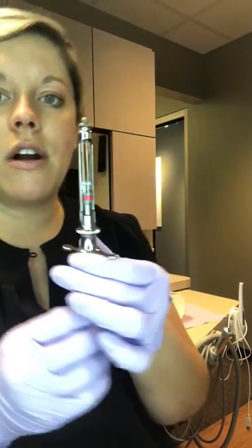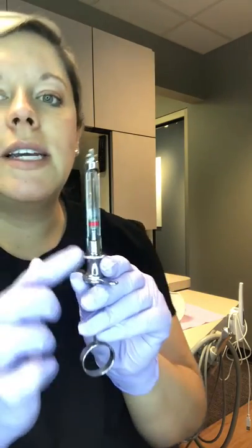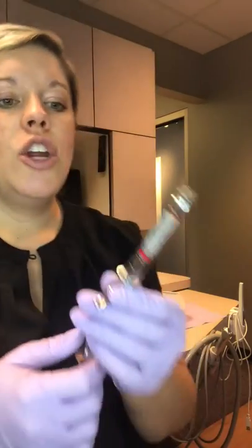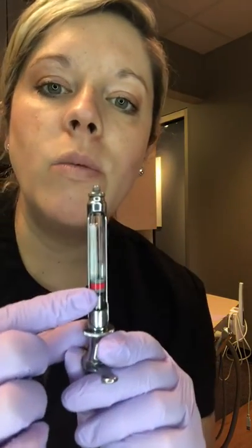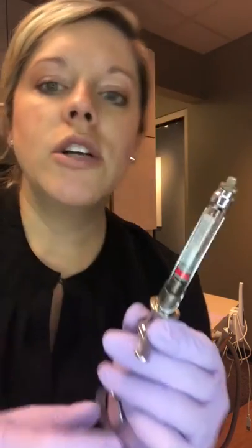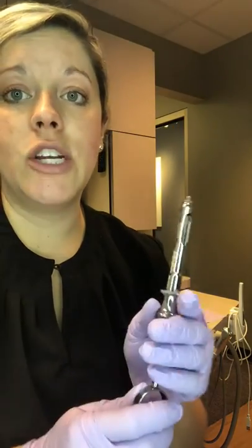We still have our needle and our cartridge left. To disengage the harpoon — that little arrow from your rubber stopper — you're going to want to pull back on the syringe quickly. If you don't, the harpoon will stay in that rubber stopper, the whole rubber stopper can come out and the anesthetic will leak out if there's any remaining. You want to pull it quickly so it disengages. Usually you'll hear a click — hear that click?